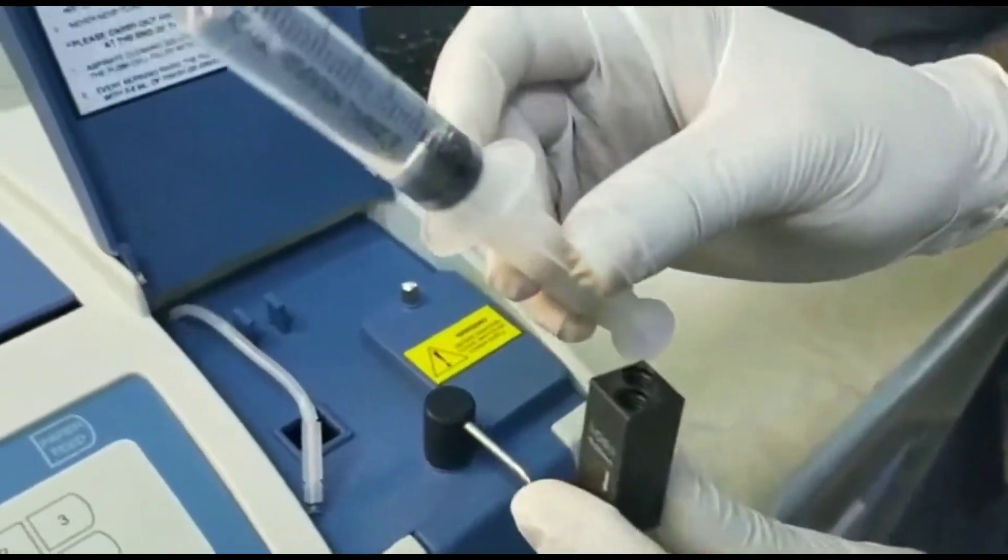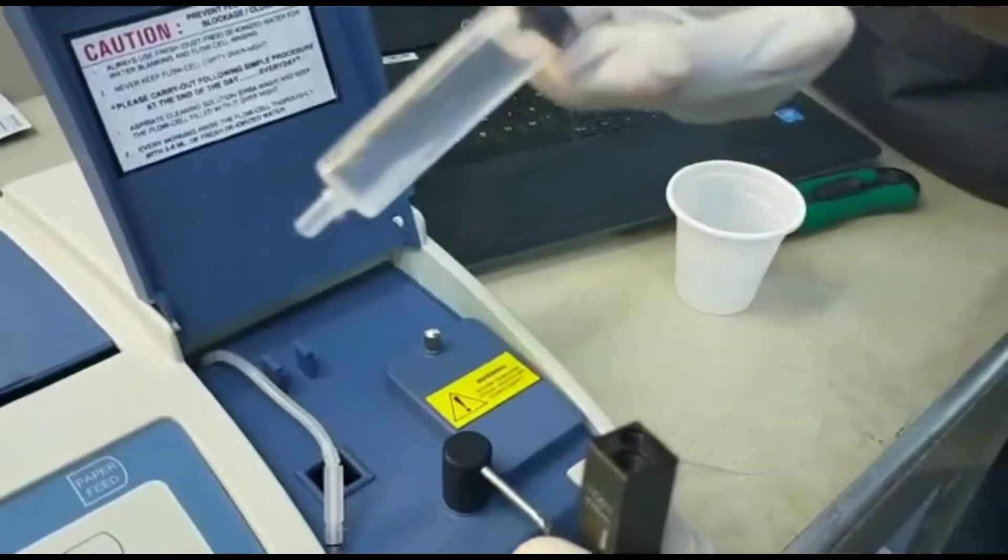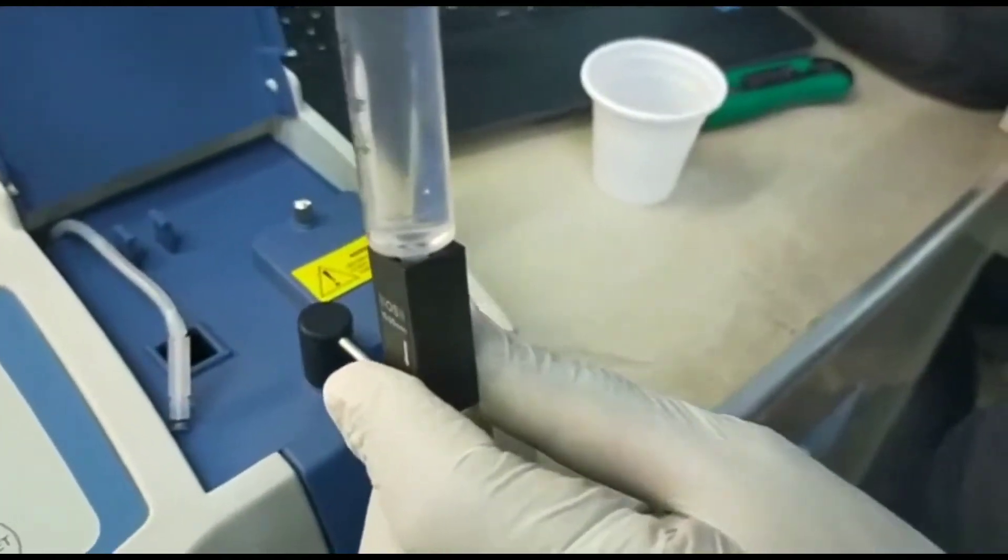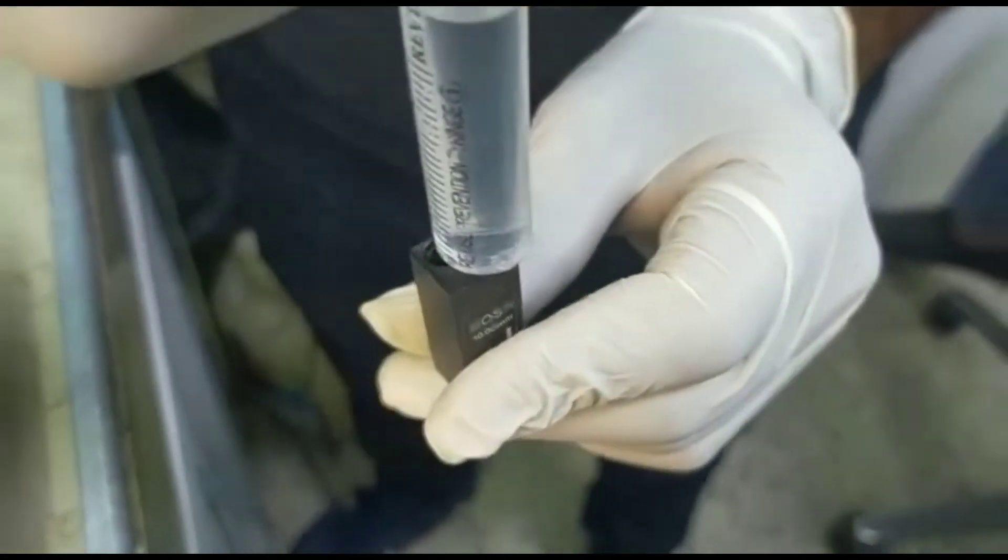Then take a syringe with distilled water, place it into one of the holes of the flow cell and then flush the flow cell.